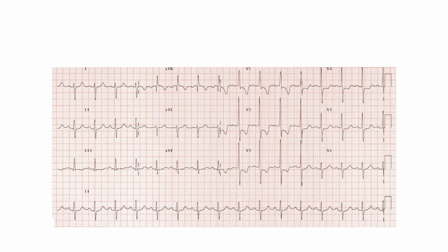So this is the basic concept of the ECG.